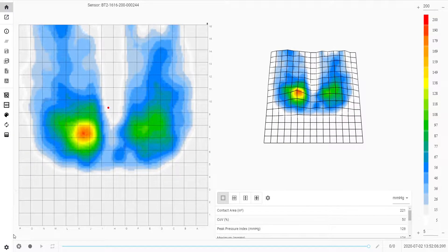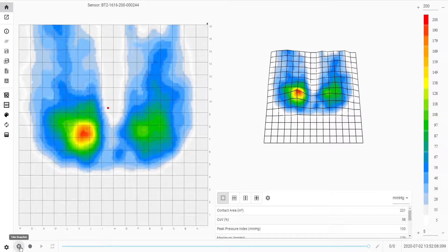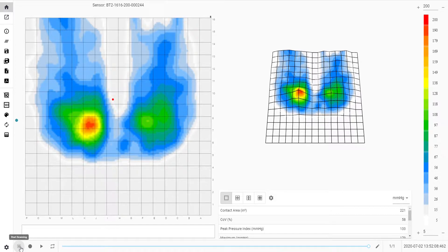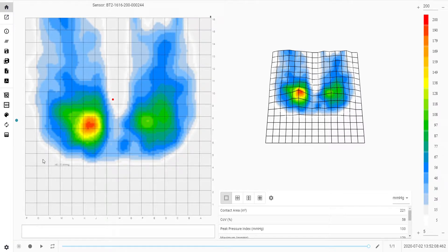You can take a snapshot with this icon located at the bottom of the screen next to the settings icon. Notes can be added to a snapshot.